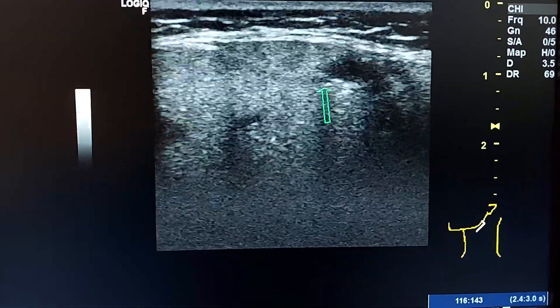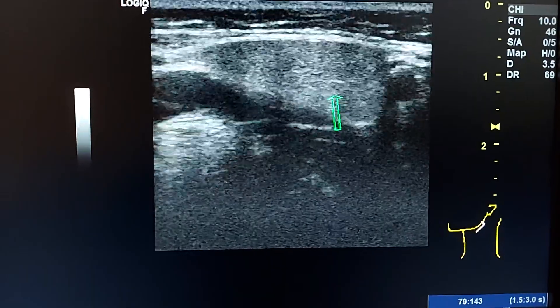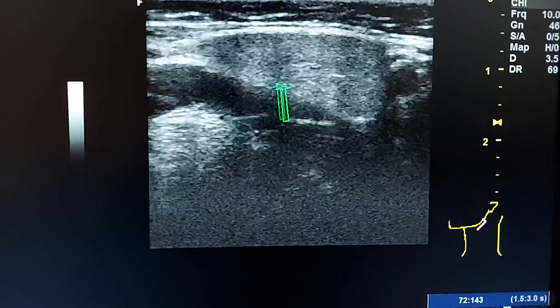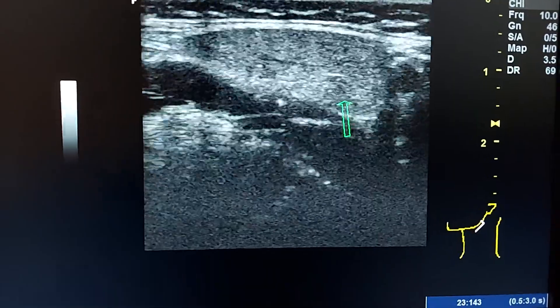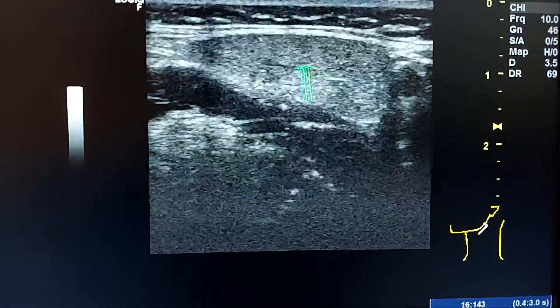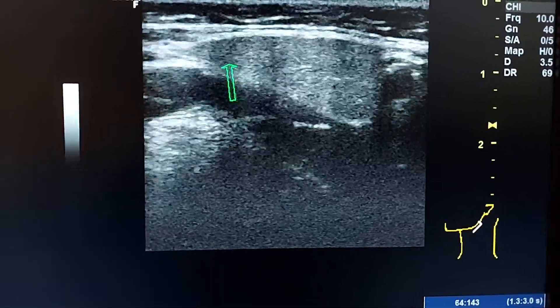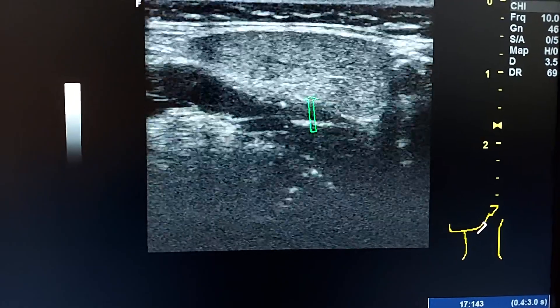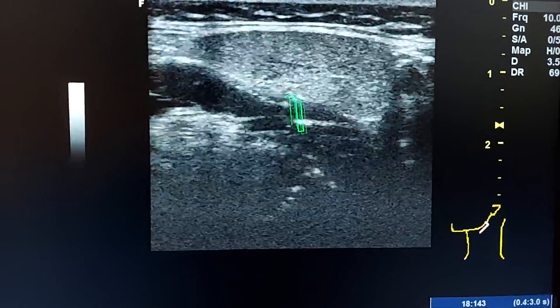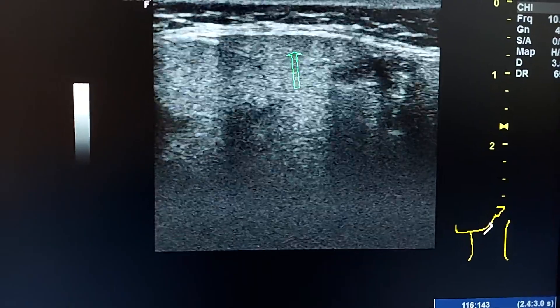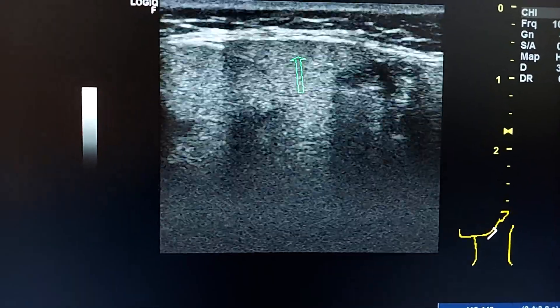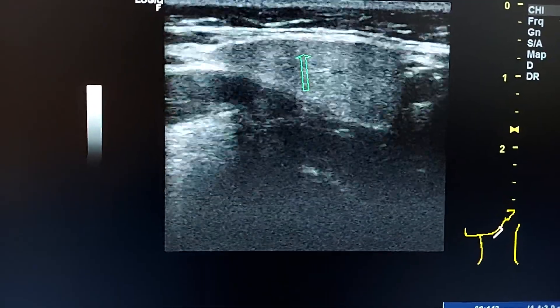This is the left submandibular normal gland. For comparison, we see it is smaller than the pathologic one and it is hyperechoic compared to the right gland.